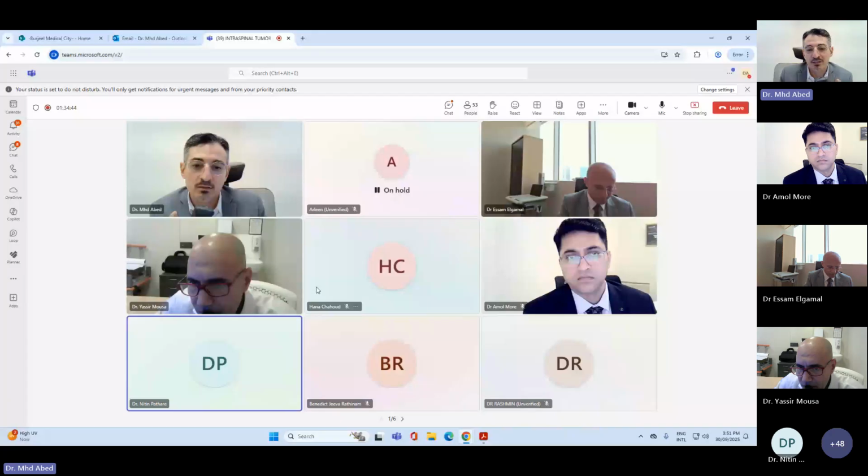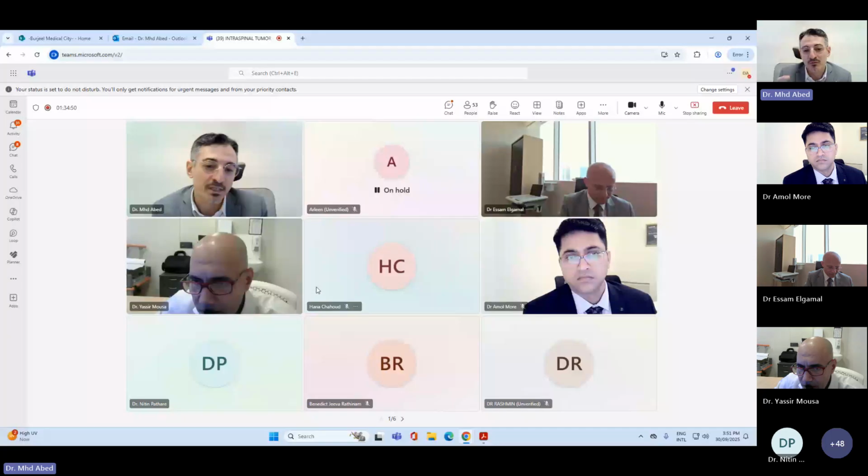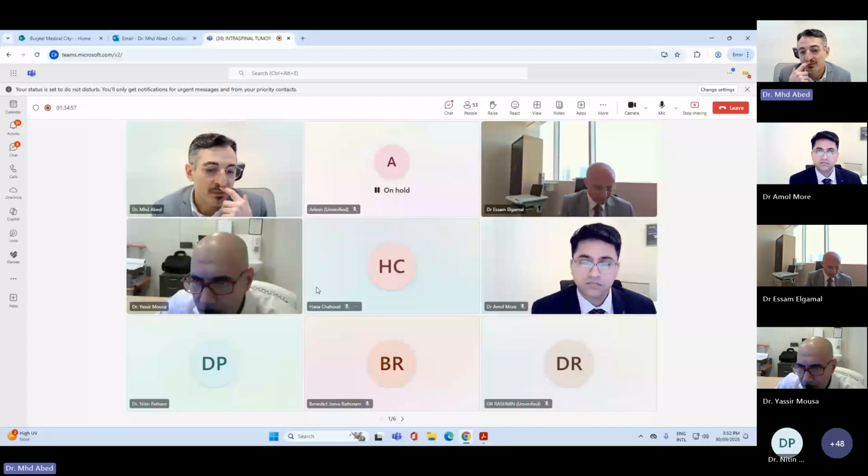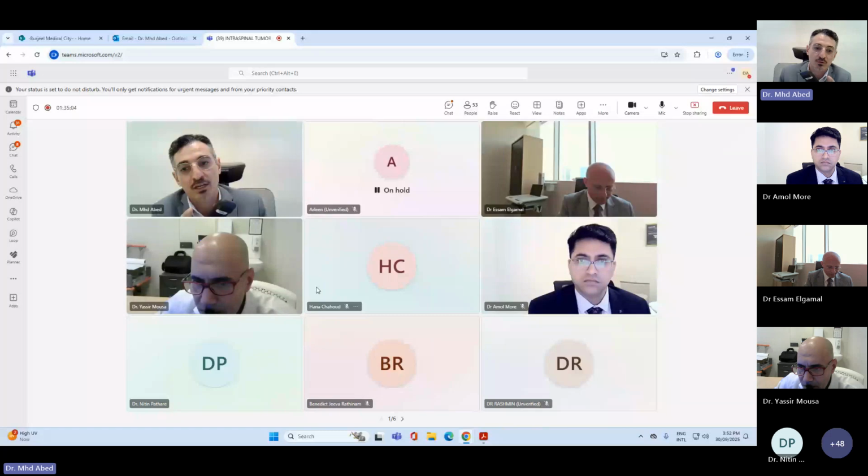Yes, of course. The prominent central canal is usually multi-segmental, but not more than 3 or 4 vertebral bodies. But if you see extensive multi-segmental enlargement of the central canal, you can't confidently say it's just a prominent central canal. It could also be a syrinx, but usually up to 3 to 4 millimeters is acceptable if it's short segmental. Okay, okay. Thank you very much.